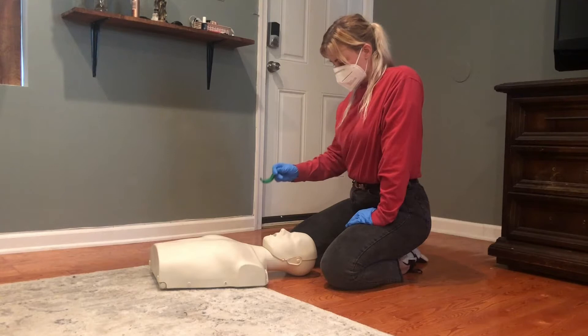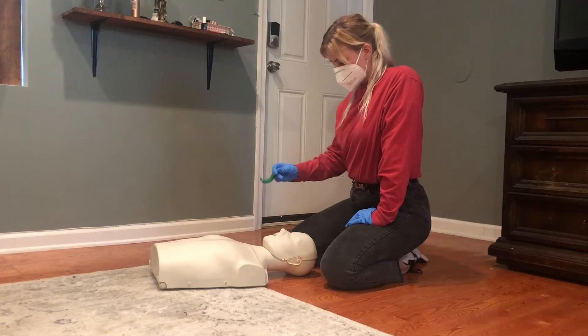If the person overdosing is unconscious and not responding and you have an oral airway, you should insert the airway before initiating rescue breathing to make sure that the tongue will not get in the way.